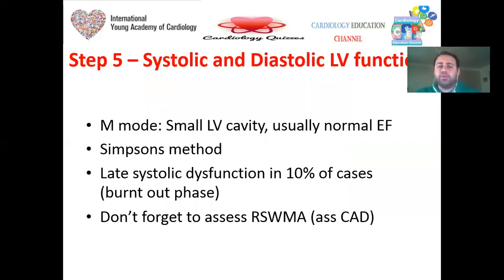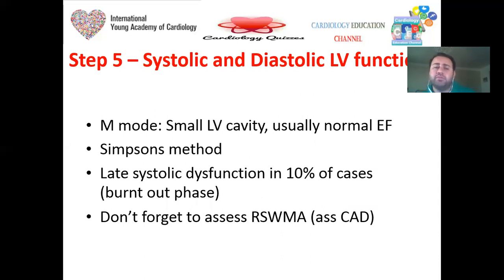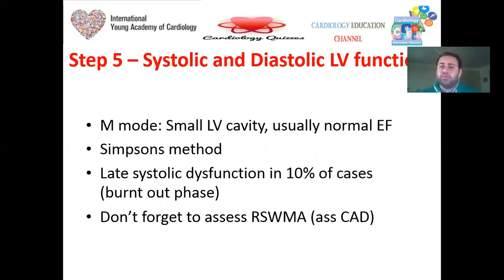Next is assessment of systolic and diastolic functions. The LV cavity is usually small in HCM due to marked myocardial hypertrophy, with usually normal ejection fraction. Simpson's method gives more accurate EF assessment. Don't forget that approximately 10 percent of cases develop late systolic dysfunction, known as the burnout phase. Also, don't forget to assess segmental wall motion abnormality, because HCM is associated with coronary artery disease — a patient may have significant hypokinesia in the anterior wall requiring intervention.